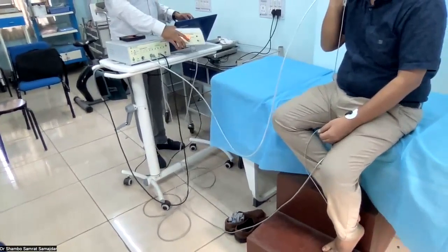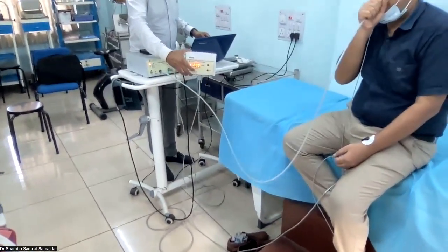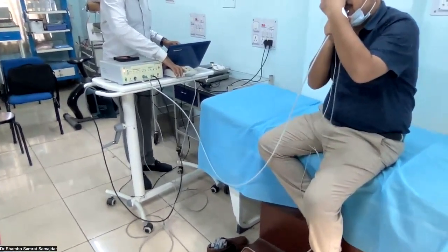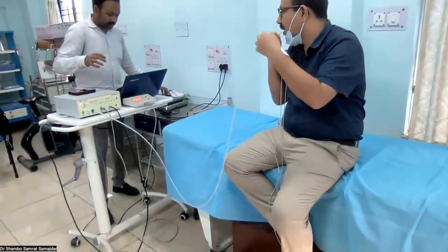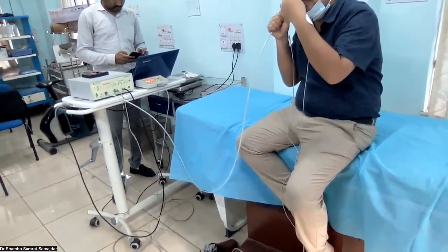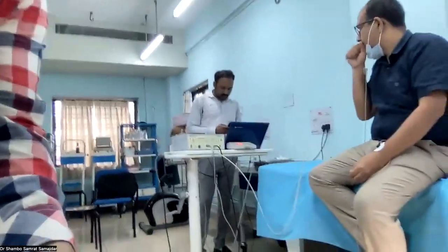So you can show that thing, please. Yeah. So there is one in that the patient can see whether he is blowing at 40 millimeter of mercury or not. Ideally, your nose should be blocked using some clips, but we don't have that clip, so you should not block that. You leave it. No problem. So like this, we are doing this test. Let's see.